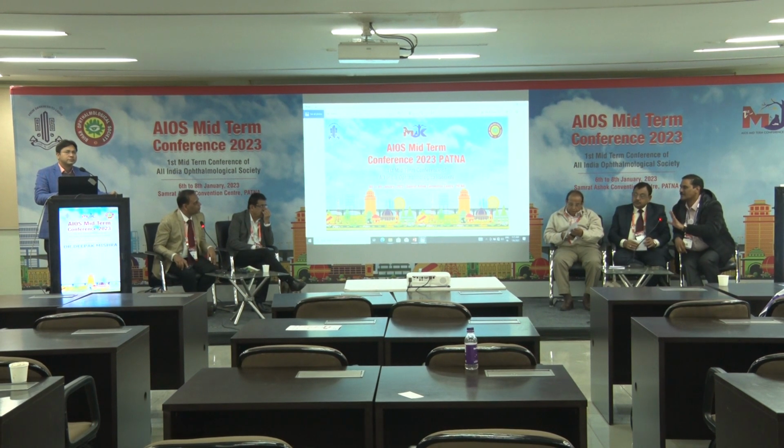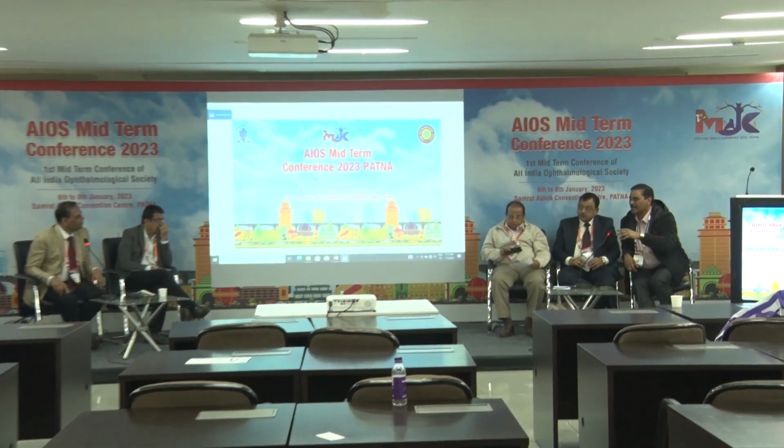For the machine you are using, you should have your post-op results on 100 patients with similar eyes, a similar surgeon, and no complications, then standardize that and use it. So even if there is a difference with another scan, forget about it. The machine you are using, the one you have standardized, you need to stick to that. And from time to time, you have to calibrate also. You have to check the other settings and all.